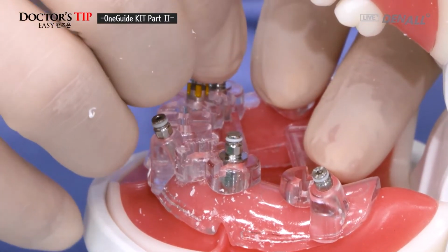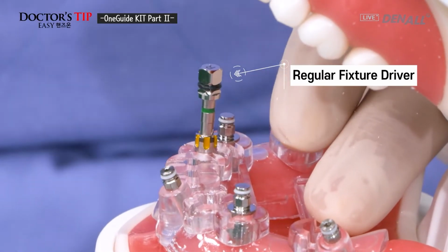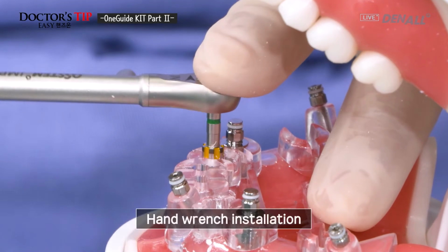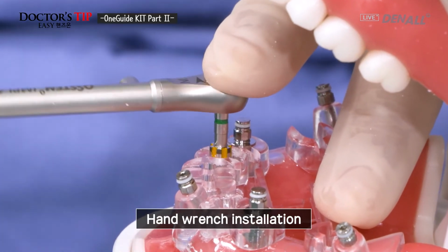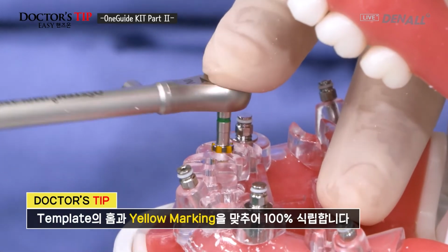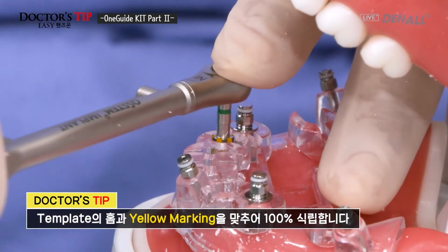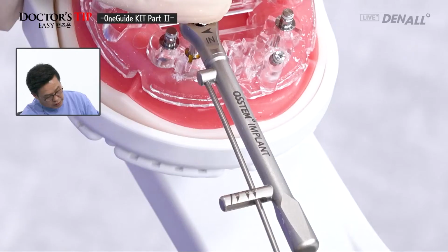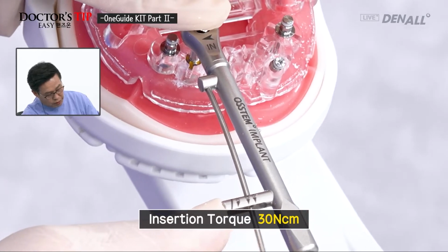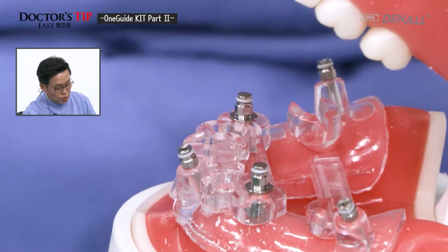So the fixture within the bone, check whether it's in contact and using hand wrench. Finally, you're going to get the implant position. The guide hole and the yellow marked area is aligned. Drilling is done for this. Now it's connected. It's approximately 30 Newton centimeters. It's connected. The other side is the same.